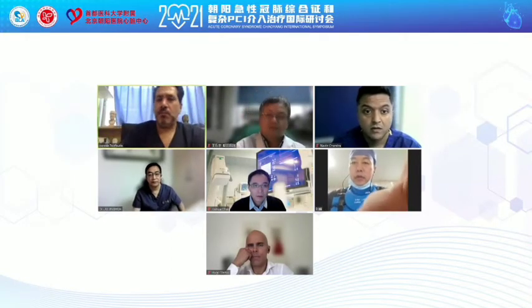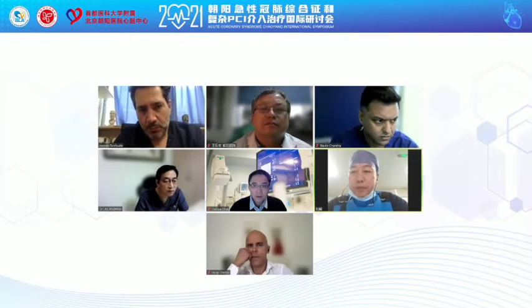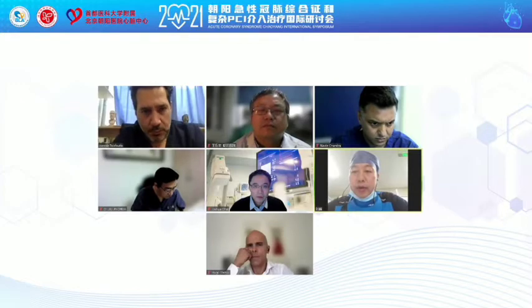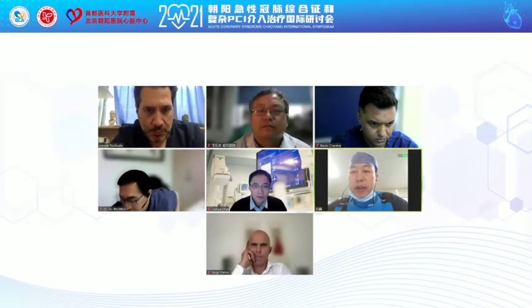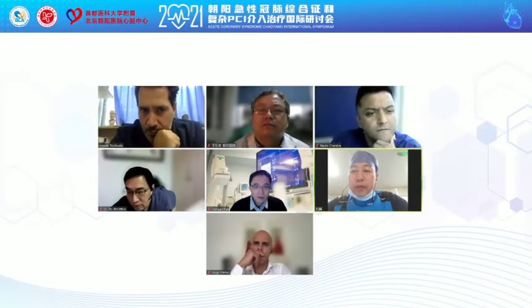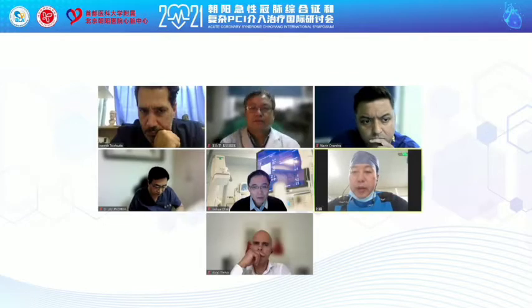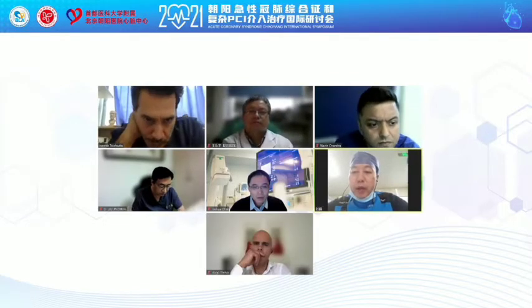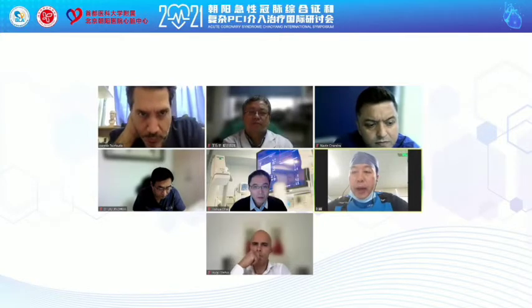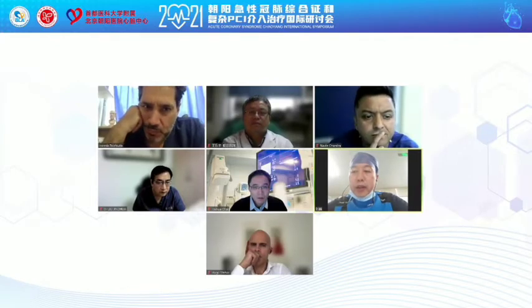Professor, it's a good lecture. It's very difficult to cross CTO lesions once the CTO lesion has a calcium nodule and if the occlusion part is very calcified. For this kind of situation, we can use this small profile balloon, or we can use laser atherectomy. And how could you decide that the distal wire is in the true lumen instead of the false lumen? Or could you advance the balloon if you cannot confirm your distal wire is in the true lumen?